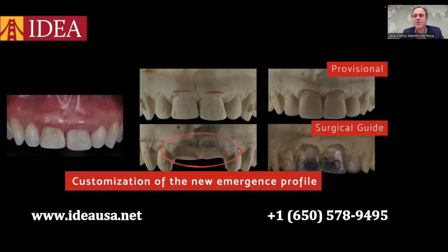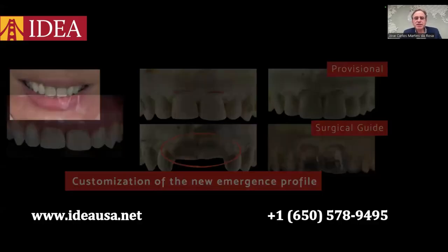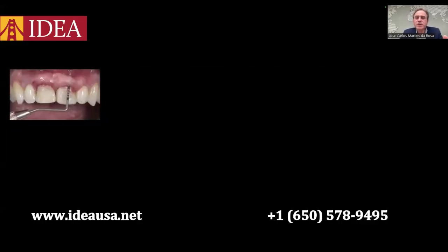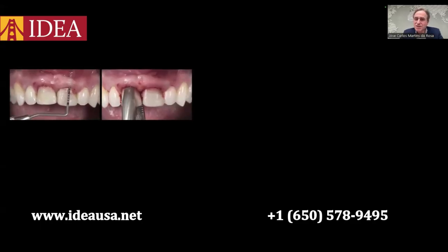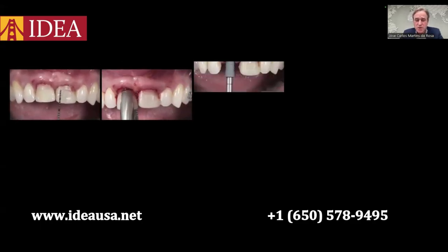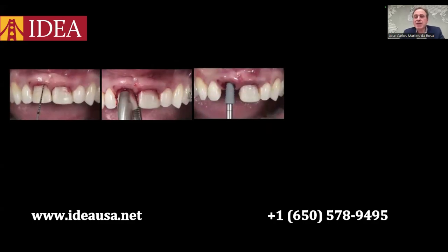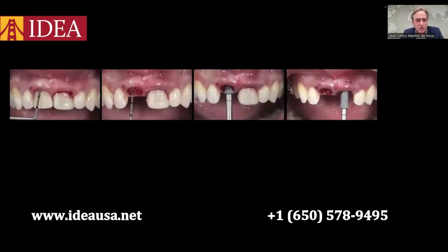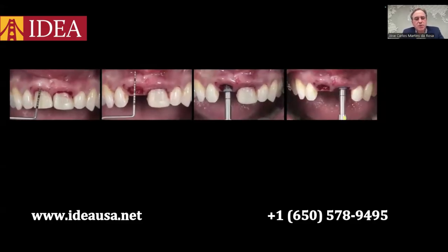Nowadays, everything is going to be done using the digital workflow. So let's see some short videos just to realize what we did. First of all, we confirmed that both buccal walls were gone. We extracted these teeth as atraumatically as possible. We did the site preparation and implant installation to put those implants in the correct three-dimensional position. This was the guide that we used to perform the site preparation.